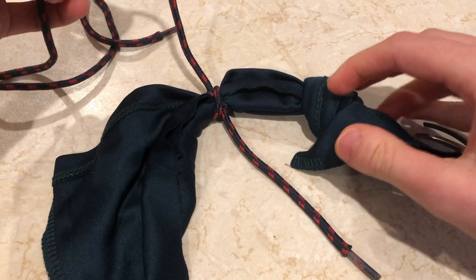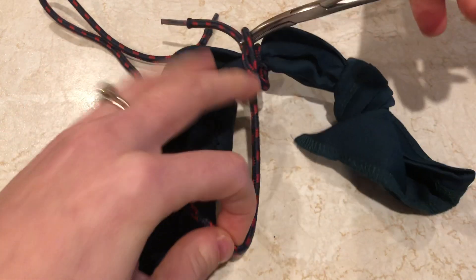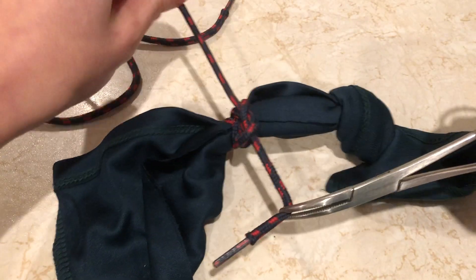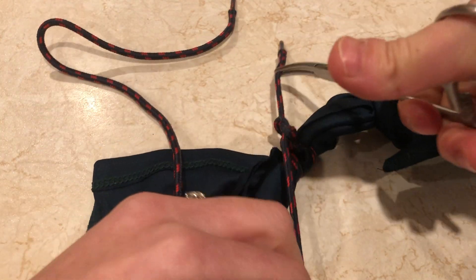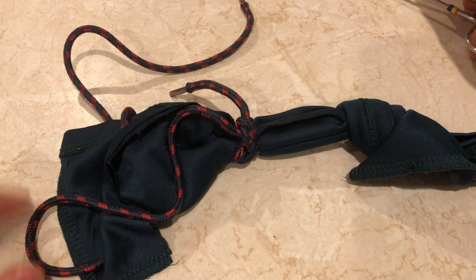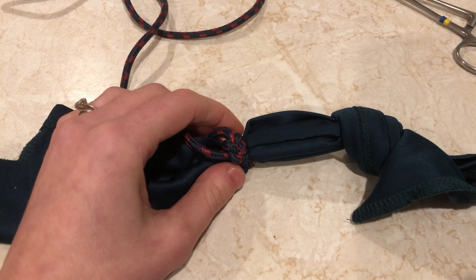Then just as normal with your needle holders you will tie some more throws on top, just as you would ordinarily. I usually do about four throws on top. That's a really nice knot. I still put two clamps on just for peace of mind, but really I don't think I'd lose sleep over one because they are so secure. I hope that's helpful. Bye!